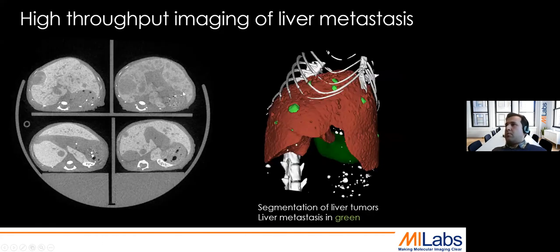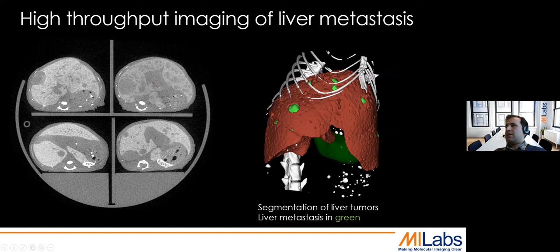When it comes to multiple animal imaging simultaneously, here is an example on liver metastasis. Four mice were scanned at the same time with contrast-enhanced livers. This allows us to see individual metastases — we can take each liver, look further, segment the metastases, and come up with a nice image showing the number of metastases, their volume, and do further analysis.